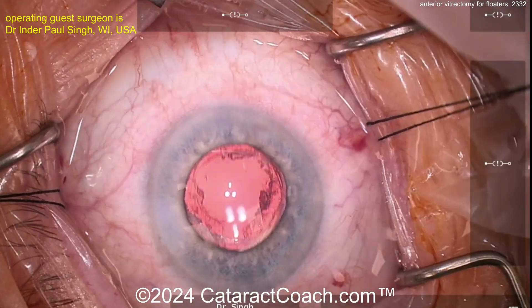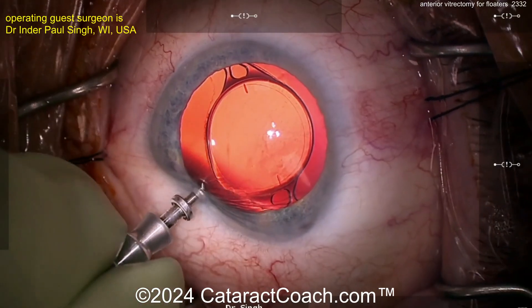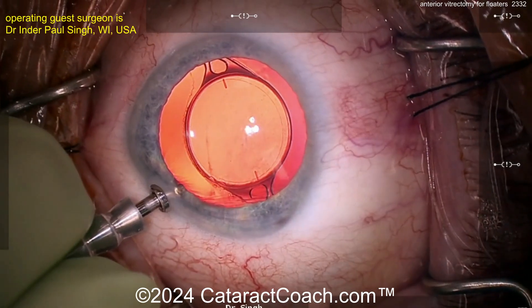By the way, we took this patient right afterwards to look at the retina to make sure there are no tears as well. Thank you so much. Okay, here we are inserting our AC maintainer again, using some irrigation to keep the chamber nice and formed.